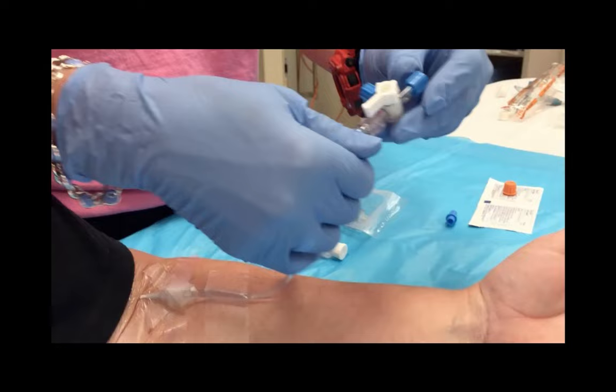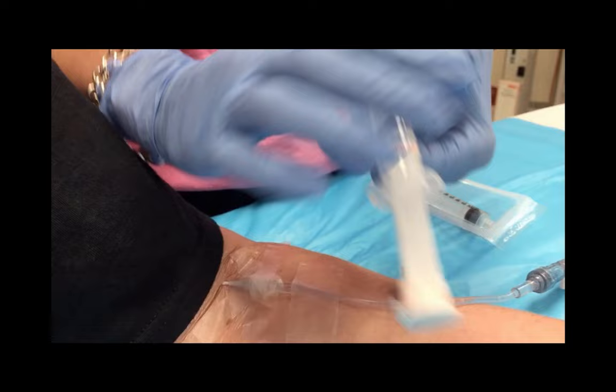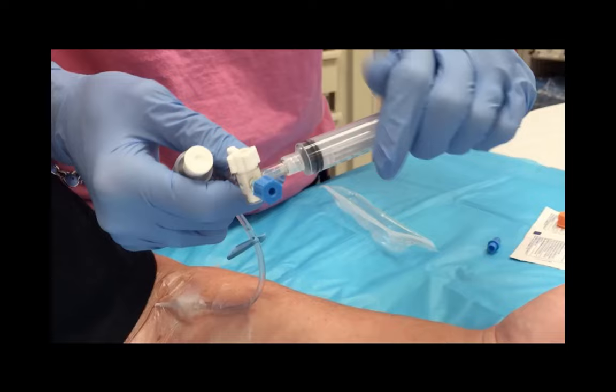Ensure that the toggle is pointed off to the patient. Next, get two 10 ml syringes. One is a saline flush — expel two mls of saline out of this syringe. Next, get an empty 10 ml syringe and draw in one ml of air. Attach both syringes to the three-way stopcock.